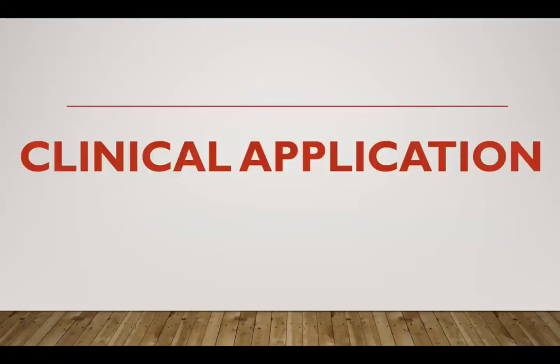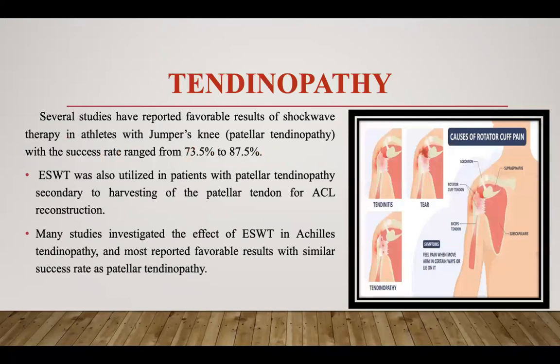Now, let's move to the clinical applications. Number one, tendinopathy. So let's start with tendinopathy. What is tendinopathy and what are the clinical applications of shockwave therapy?